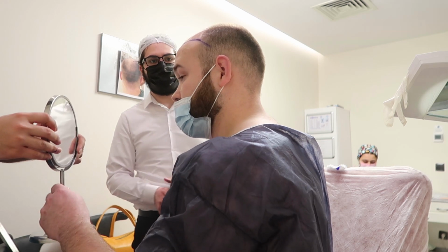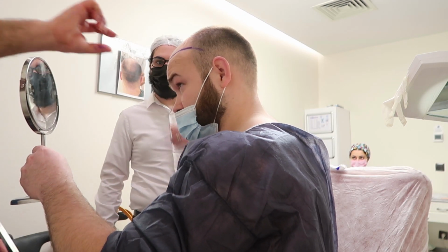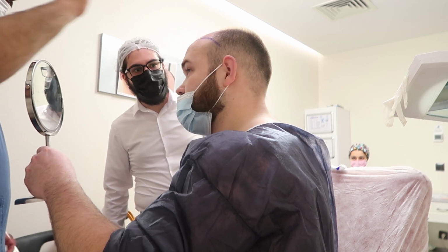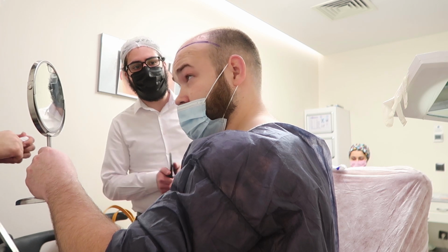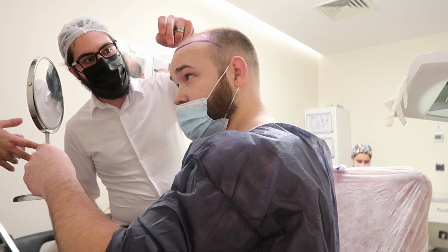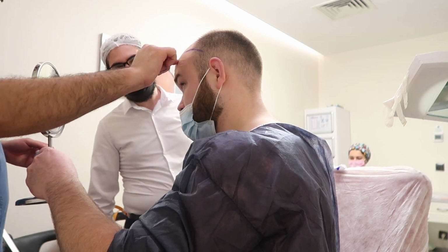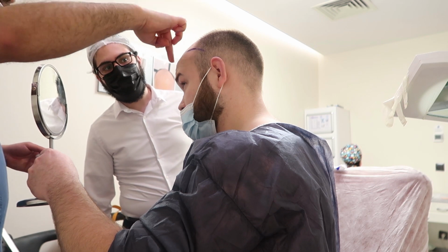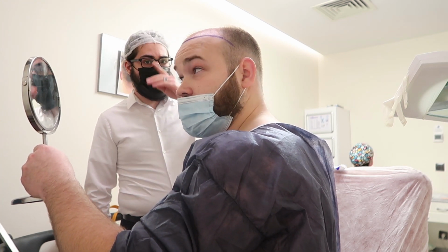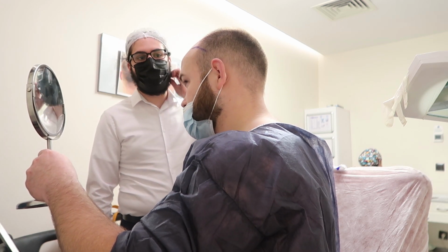So the transplant will start from the back here till the blue line. He said that it's gonna be the most natural for you. So it will be the transplant from here like this till the back of your head. So whether you open your eyebrows or you make it down, it will be the same. So this is your natural hairline.